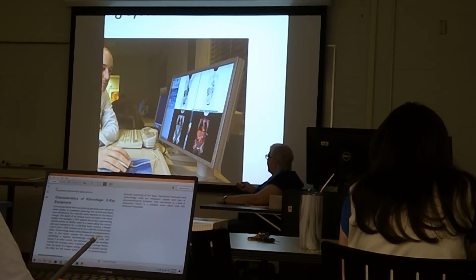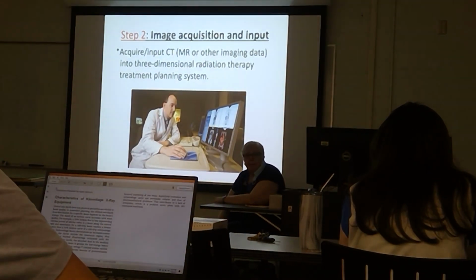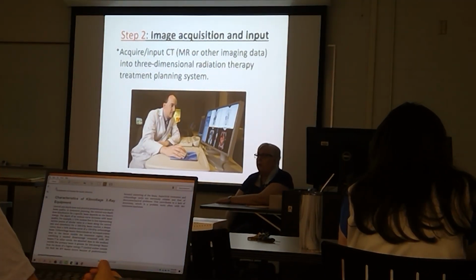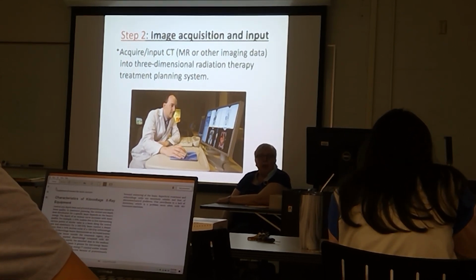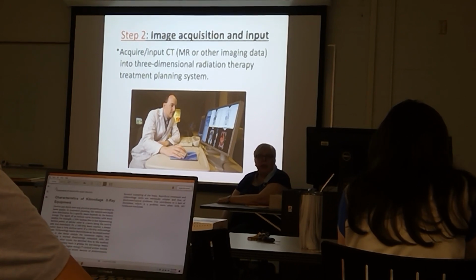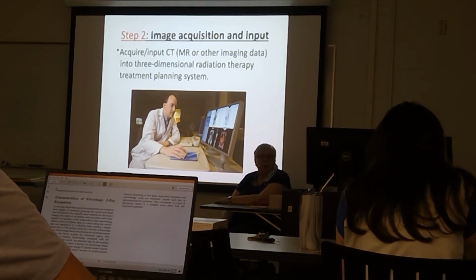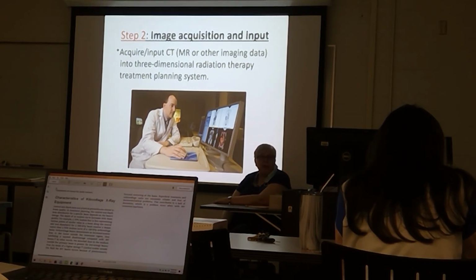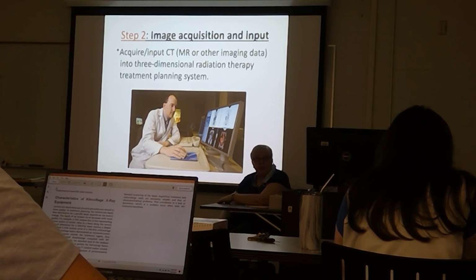The one thing that, just out of curiosity, is that if you're doing a PET scan, or even a CT PET scan, you have to provide a washroom or a toilet for patients because they are radioactive, therefore their urine is radioactive for a certain length of time.